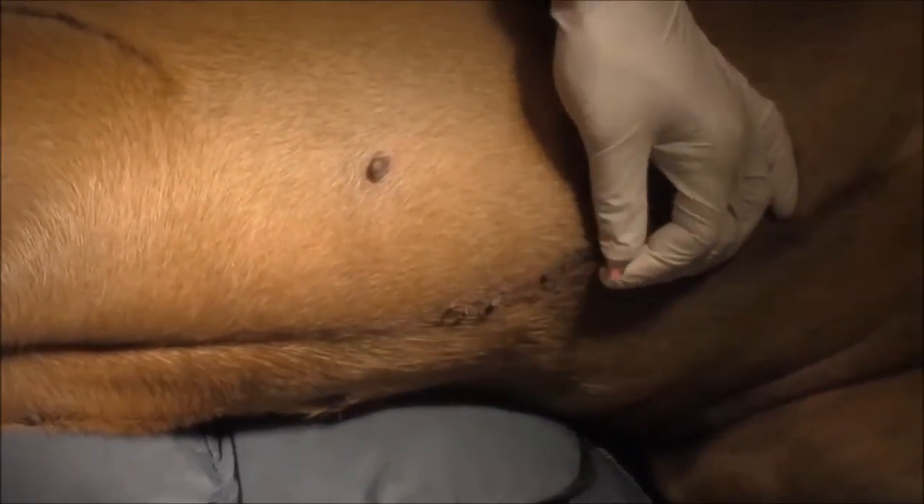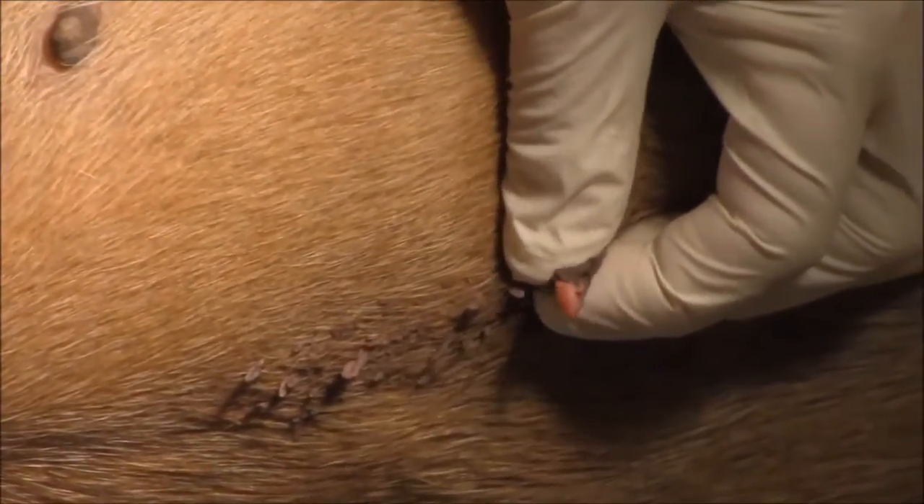Right here is Angus. Angus is about a 5-year-old bull mastiff and he gets these skin tags on his belly. You can see he's got a lot of them — I've taken them off, I've frozen them off, and they come back repeatedly.